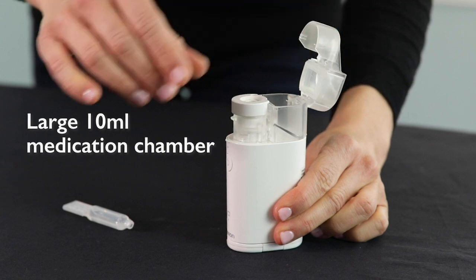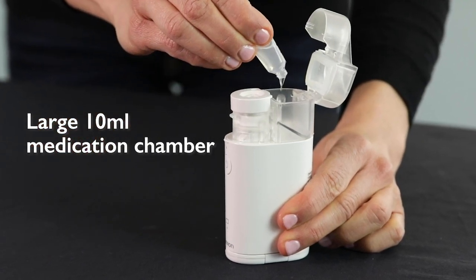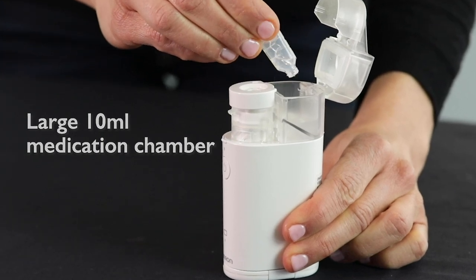The medication chamber has a 10 milliliter limit and is bigger than all the other portable units that we sell, and the unit itself is really good at taking in all of that medication.